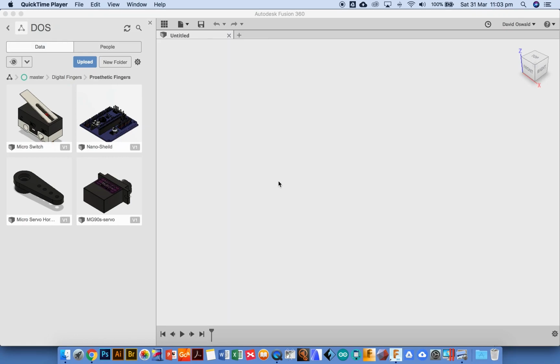Once you've opened Fusion, the very first thing we're going to need to do is to create a new folder. So create a new folder within your master folder. Call it prosthetic fingers. And then you'll need to go to Compass, download the zip folder that contains these two parts that I bought from eBay, the models of them that I got from GrabCAD. This is the nano shield that I've got from GrabCAD, and again this is the servo horn that I've got from GrabCAD. All of those parts are going to be needed later when you start to assemble.